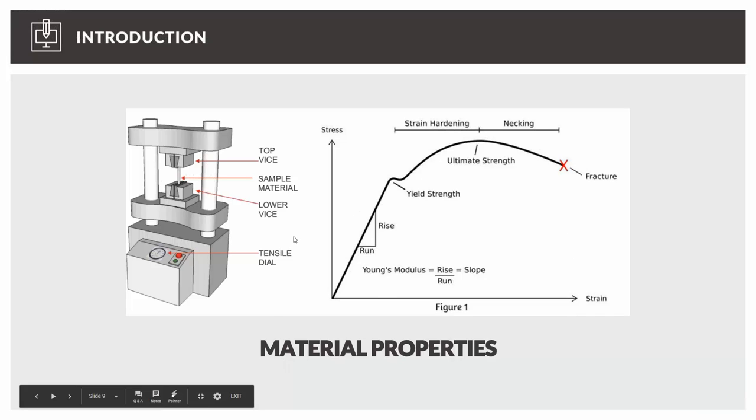The reason is that basically what we are doing when pumping up the stent is that we are making sure that the deformation of the stent is a plastic deformation, which is permanent. And in the end of the day, we want our expanded stent to be somewhere near the ultimate strength, because there we already have strain hardening, which means the material becomes a little bit harder. And on the other hand, the shape won't change anymore.